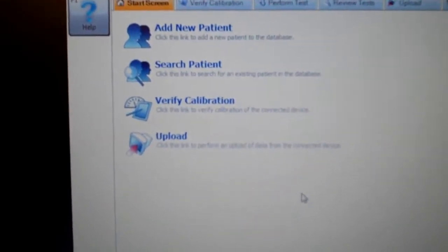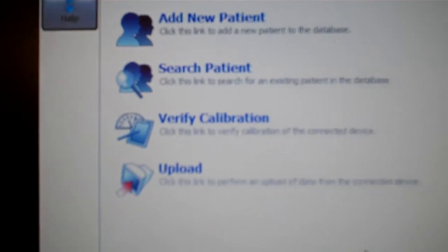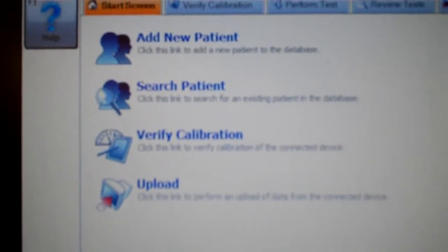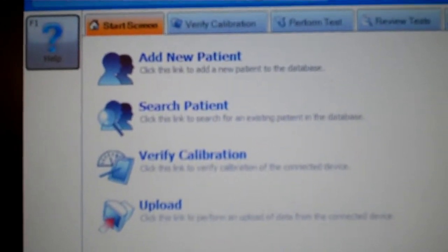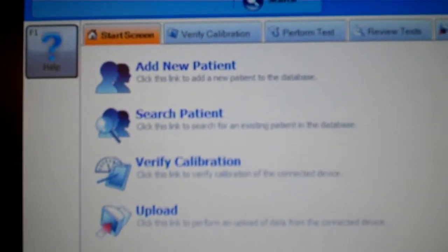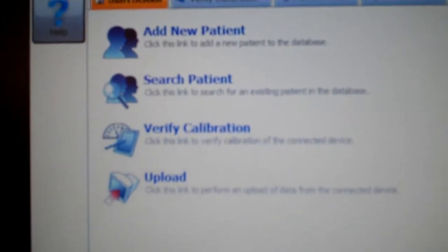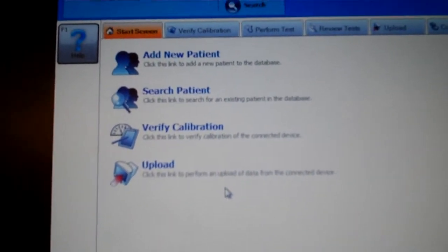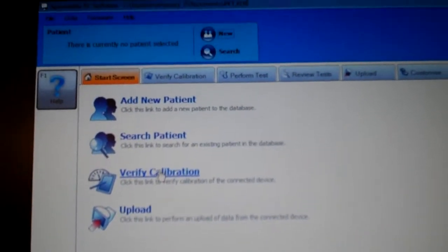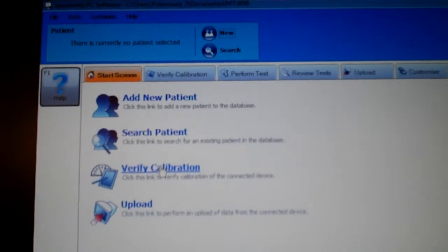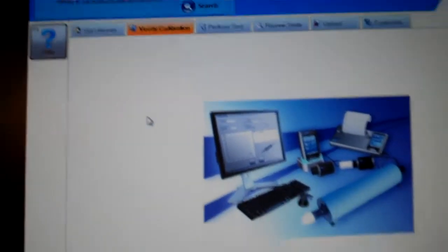When we get to the main screen and open up the program, you will notice that we have some choices: Add new patient, search patient, and verify calibration. We are going to select verify calibration, and then at the very bottom of the screen, you will see it says verify calibration, so we will click on that.